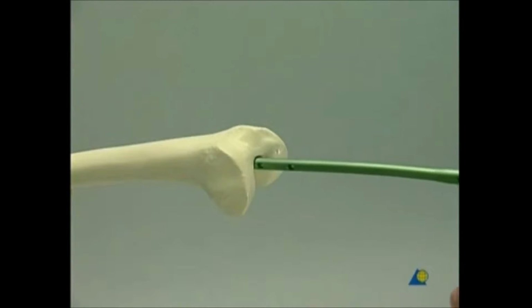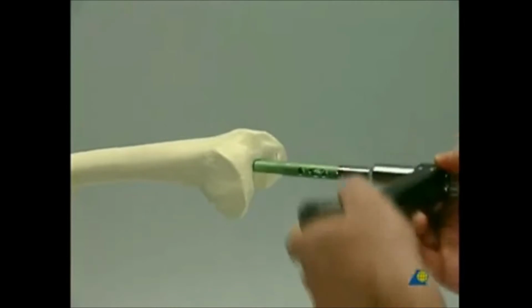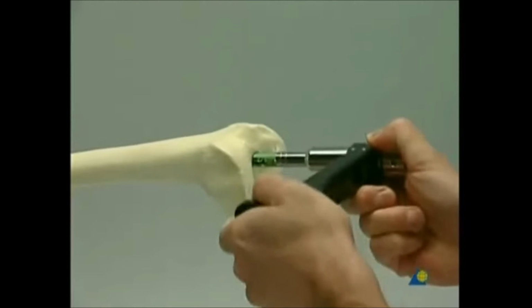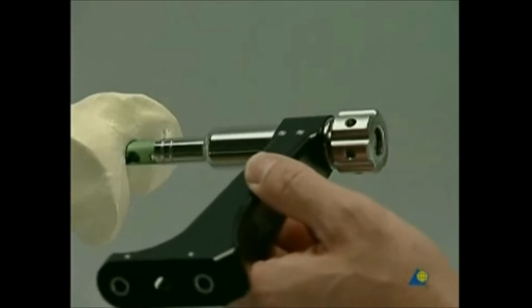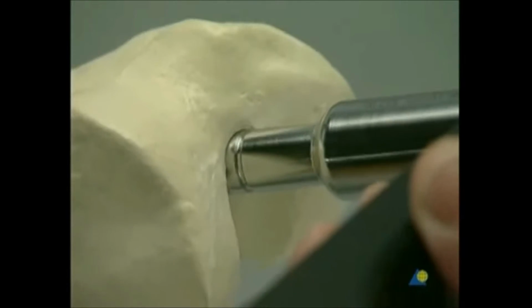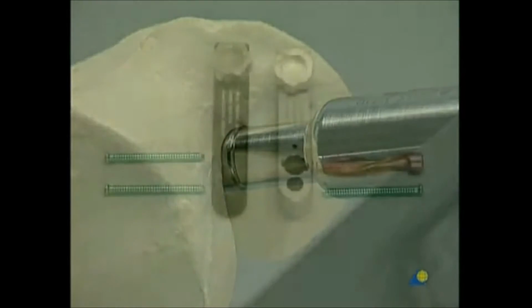The nail is inserted by hand through the entry point and with gentle rotary movements into the canal. Sometimes light hammer blows are required to insert the nail. The final position of the distal end of the nail should be 2 to 5 millimeters beyond the articular cartilage. The insertion depth can be read from the ring marks on the insertion handle.